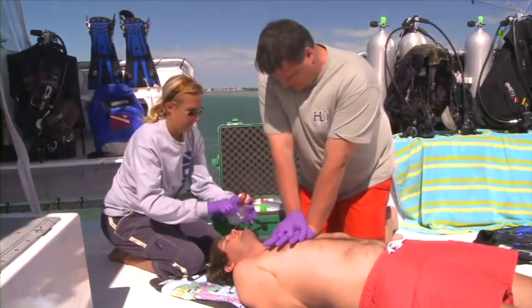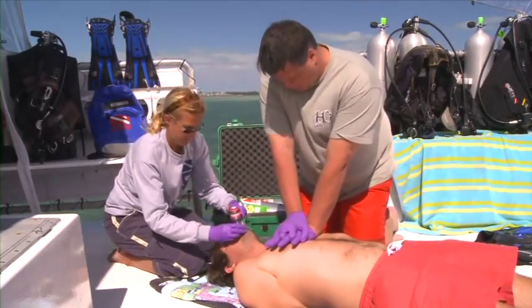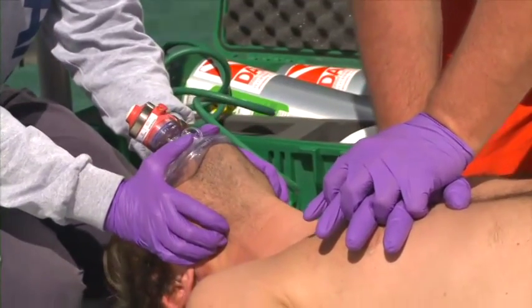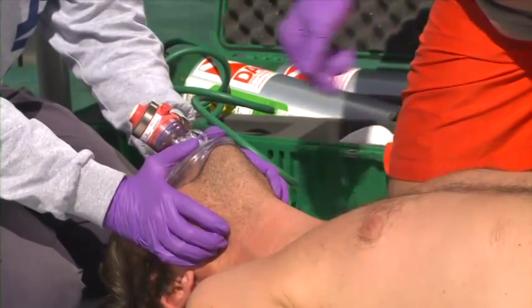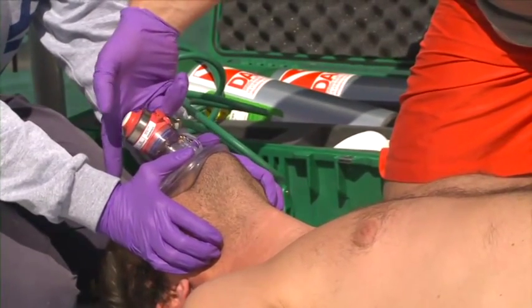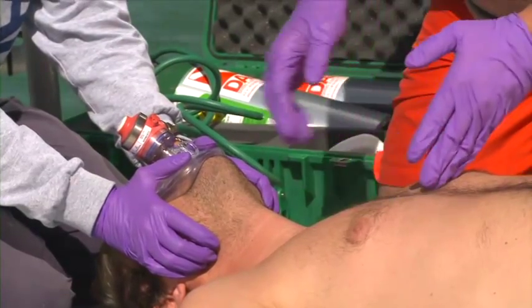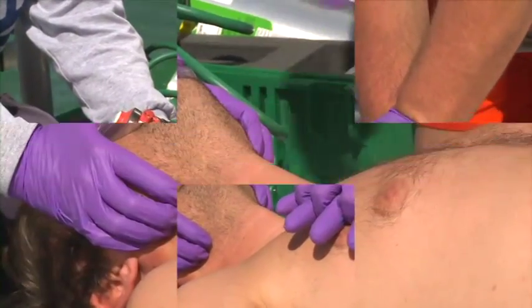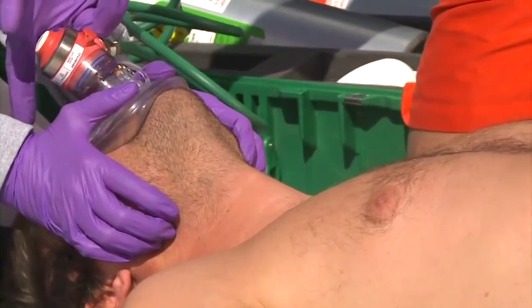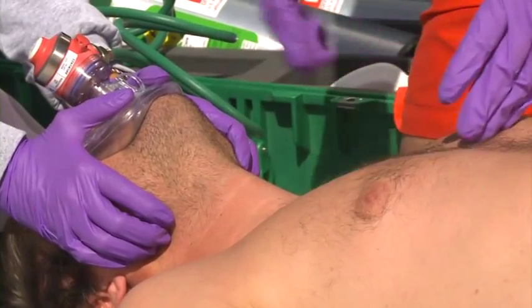Position yourself near the patient's head. Place the mask over the patient's face. Lift and hold the jaw into the mask as you open the airway. Depress the button on the device, ventilating the patient with 100% oxygen until the chest rises. Allow complete exhalation. Each ventilation should last about one second and create a visible rise and fall of the chest.